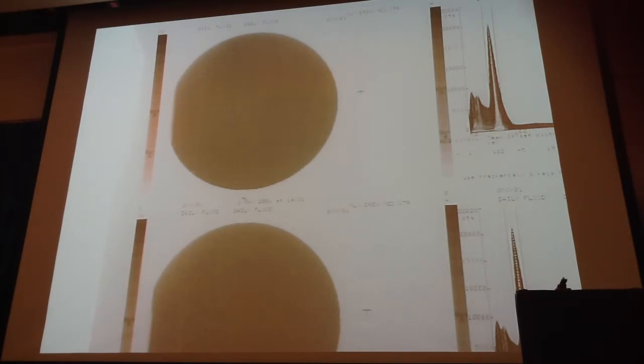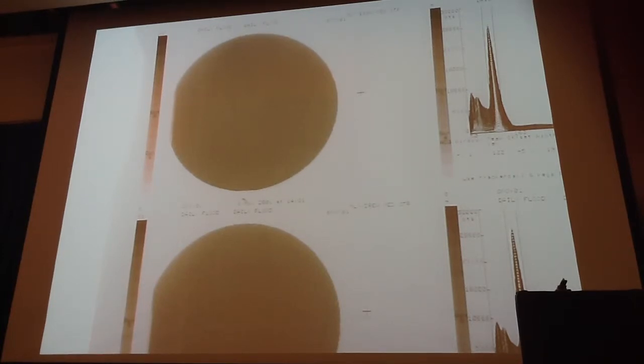But intrinsic means that you do not have the collimator on. So you typically use a point source of technetium. Extrinsic means that the collimator is on, and you'll either use what they call a flood source or a flood phantom. Does anyone know the difference between a flood source and a flood phantom? What is the difference? Yeah, Monica. You gotta be faster in here.